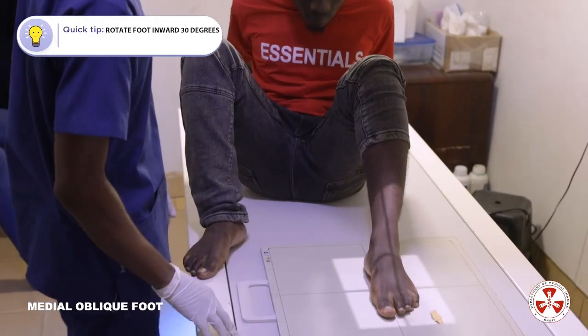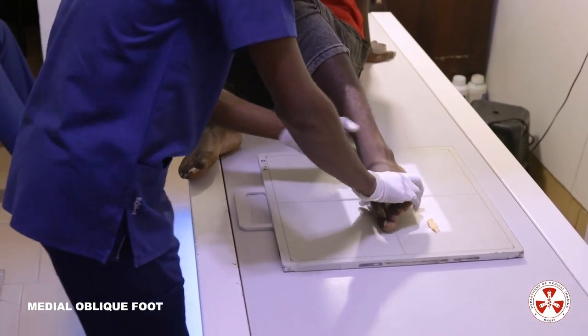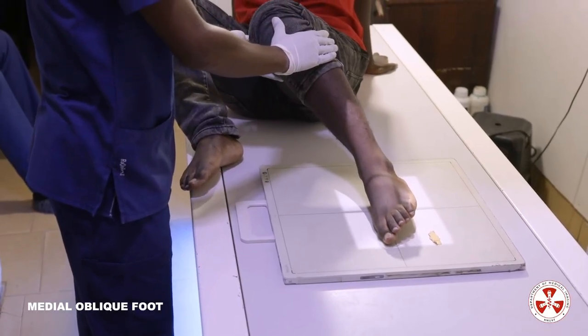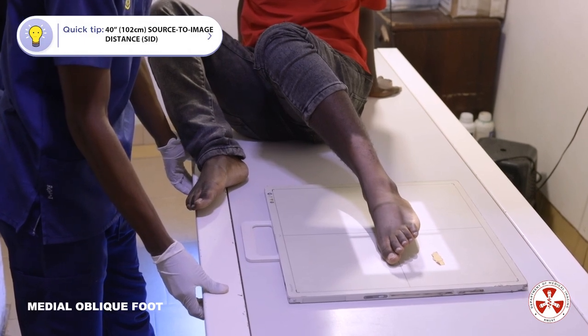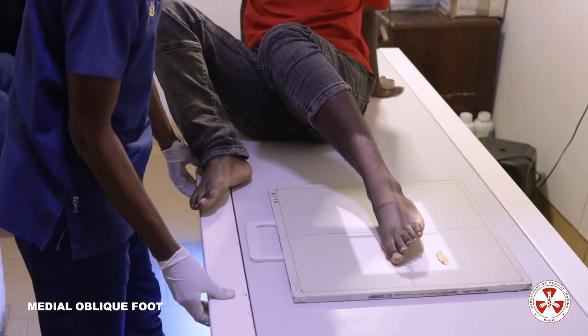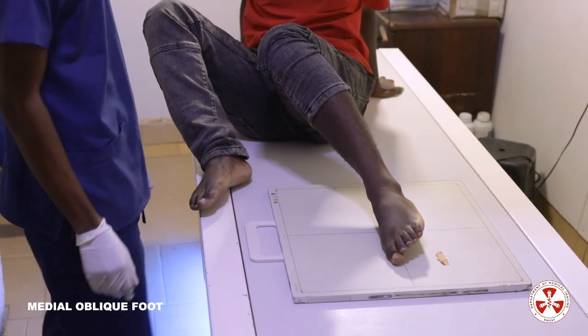Instruct the patient to rotate their leg inwardly at a 30-degree angle and center at the base of the third metatarsal. A steep rotation will superimpose metatarsals, so a 30-degree angle is optimal and best to demonstrate the cuboid. Collimate to include the area of interest, shield, and make the exposure.